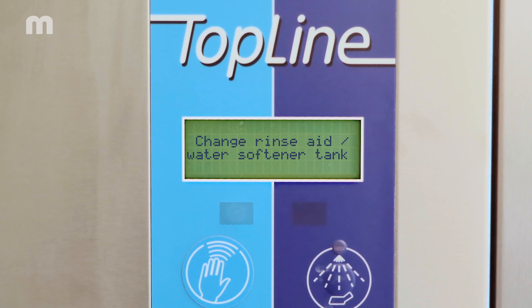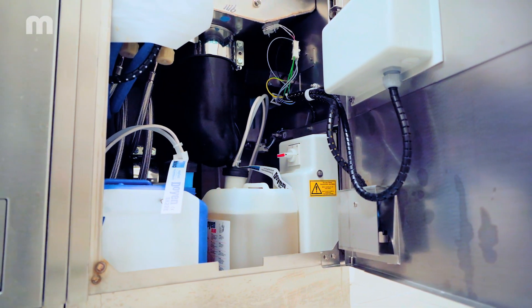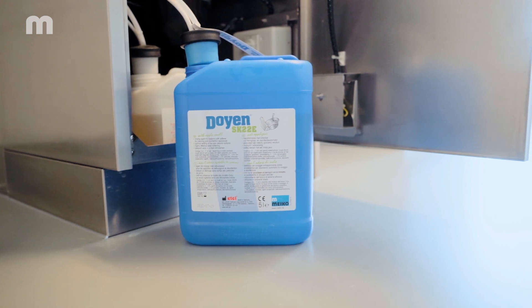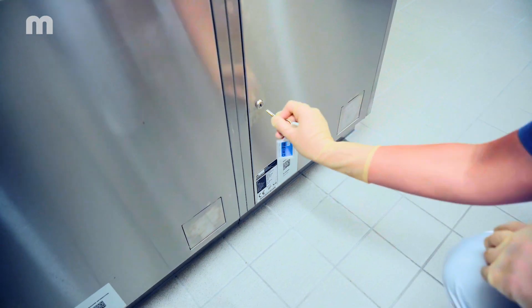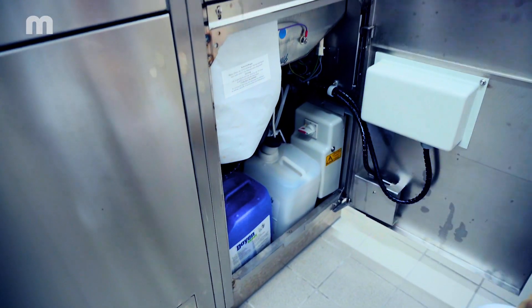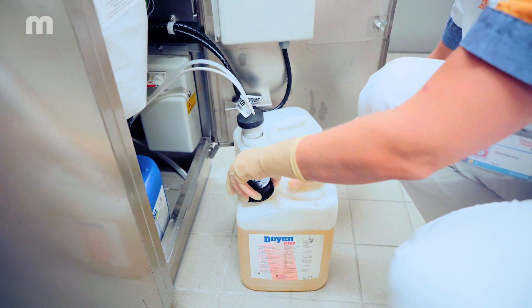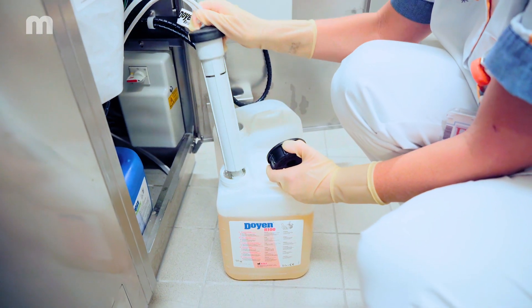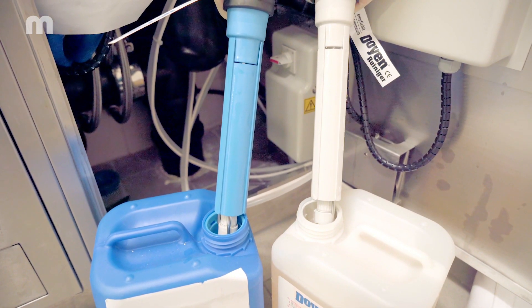The display on the bedpan washer disinfector shows when the canisters containing detergent and/or rinse aid need to be replaced. Please note these liquids are chemicals, so always read the supplier's instructions before using them and take the necessary precautions. Open the door of the compartment where the canisters are located, take the suction lance out of the empty canister and place it into the full one. Make sure the suction lance is standing upright in the canister.